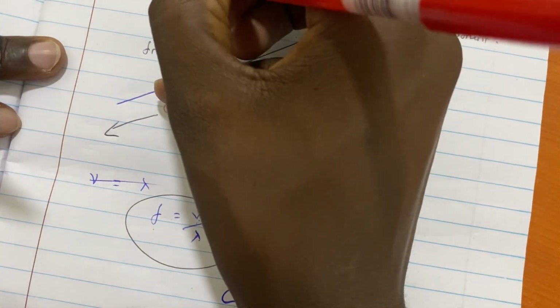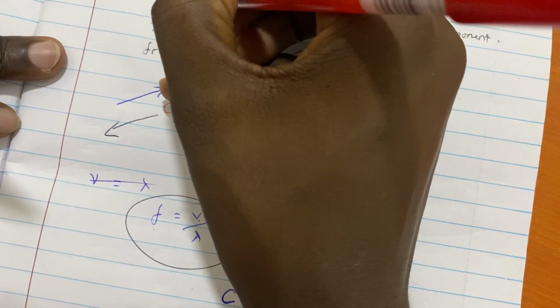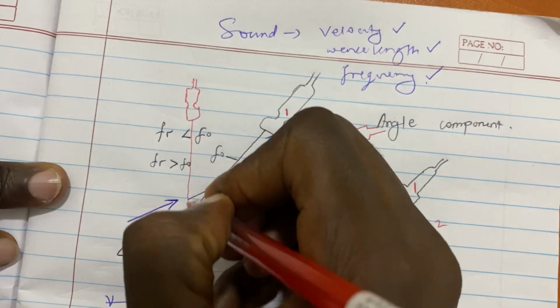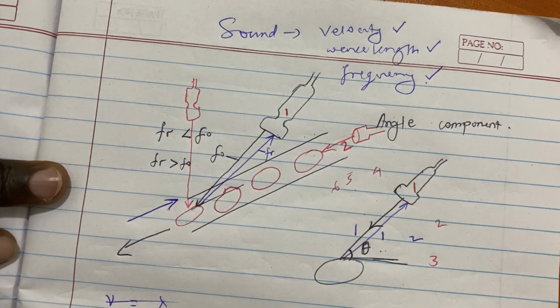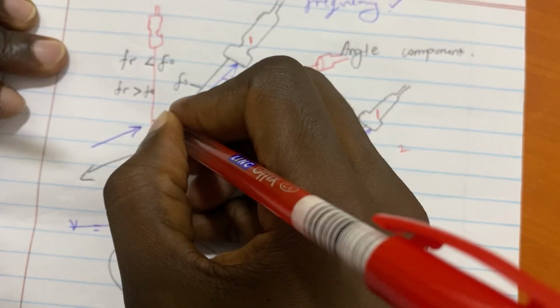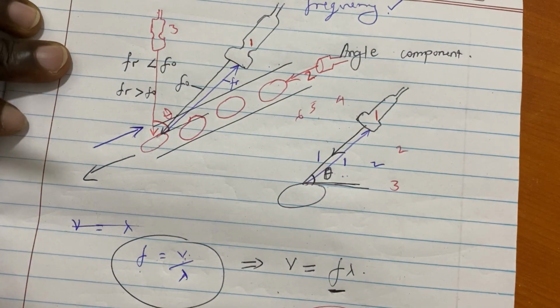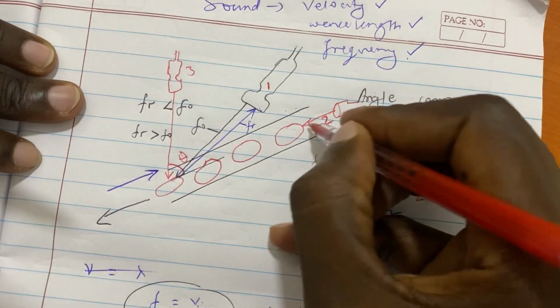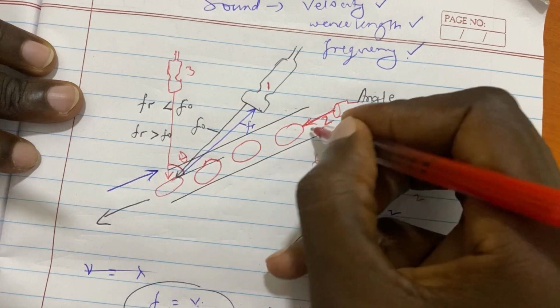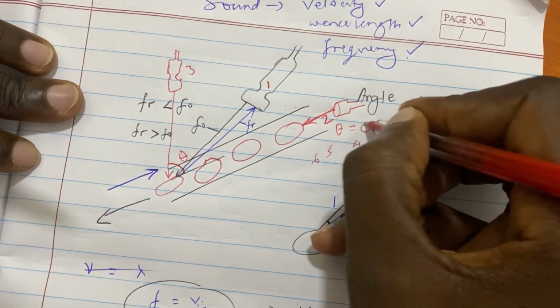You can decide to put it here, so that it transmits like that. So any position you choose. If you put it here, this is the theta you're getting. If the position is position 3, if you put it here, it is almost parallel, so you are almost getting a theta of, at position 2, the theta is almost 0 degrees.